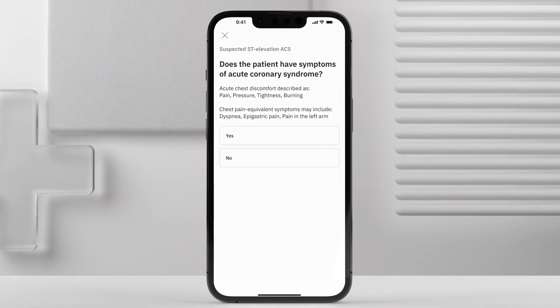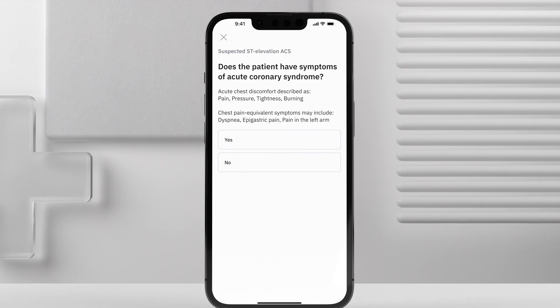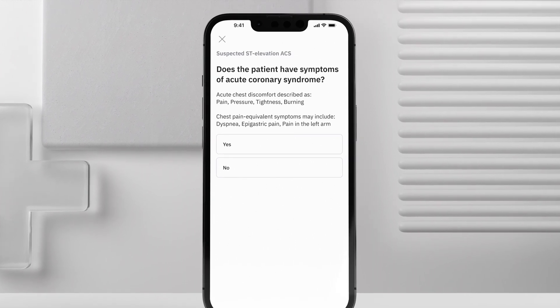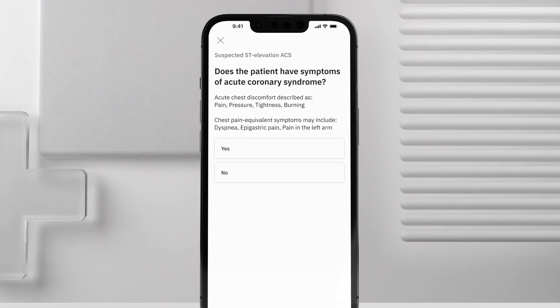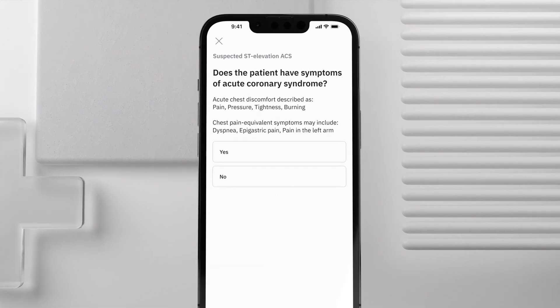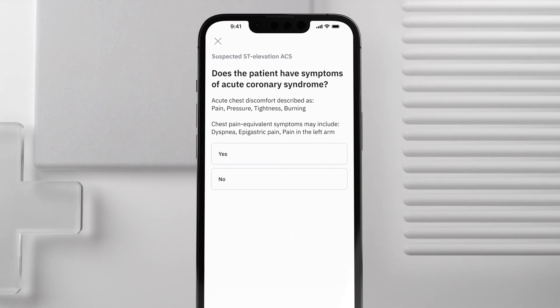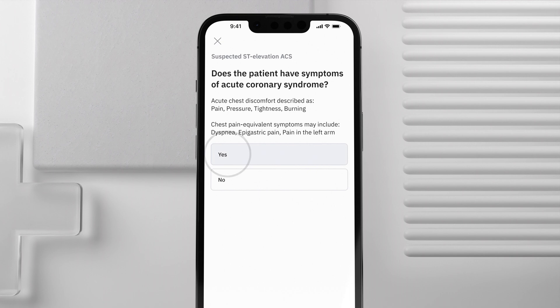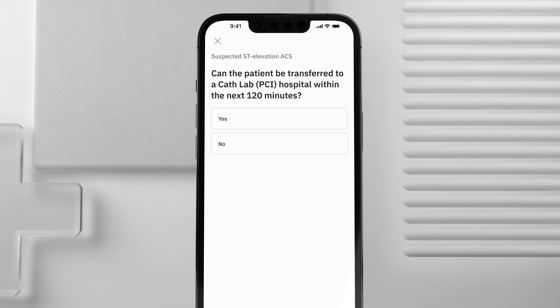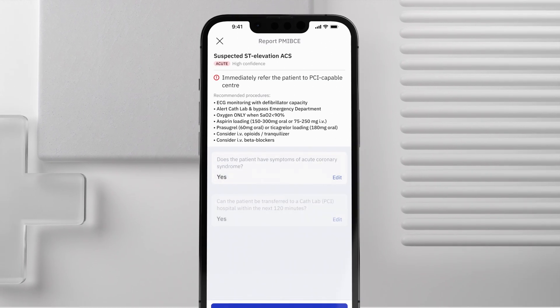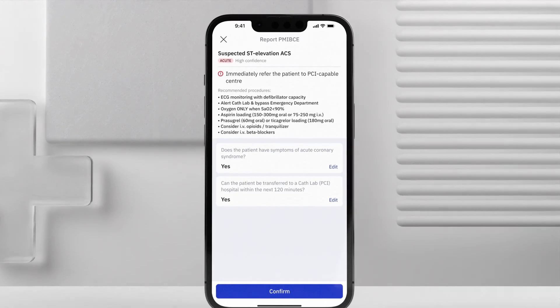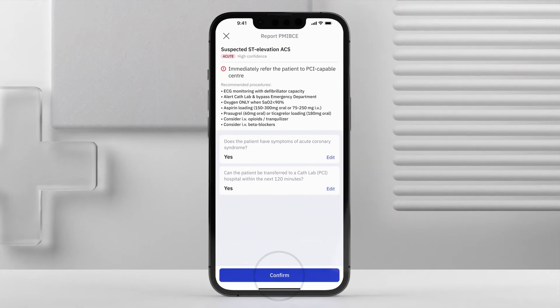PM Cardio will now ask you a series of questions to determine the best course of action based on the latest clinical guidelines. Tap to select the option that applies. Double-check your answers and tap Confirm.